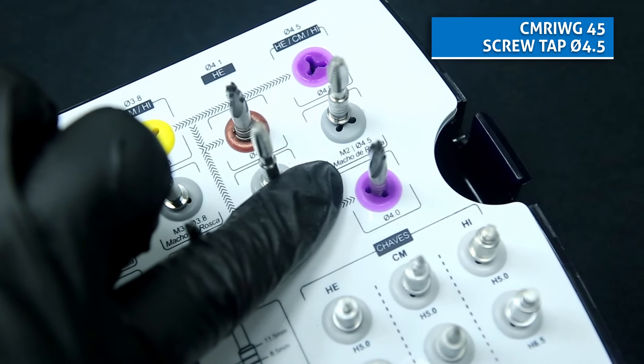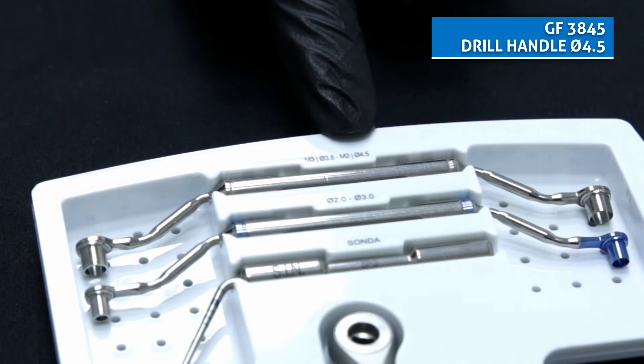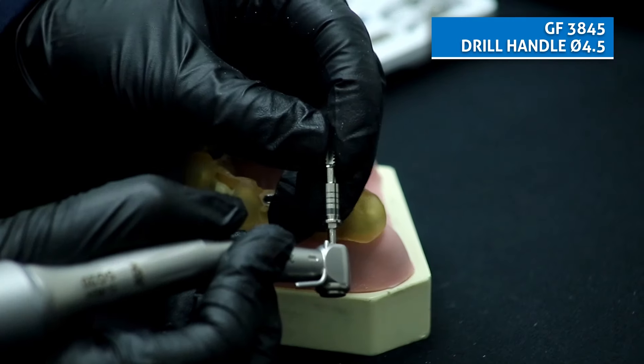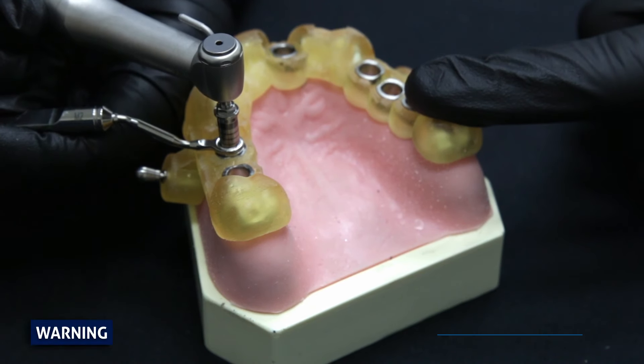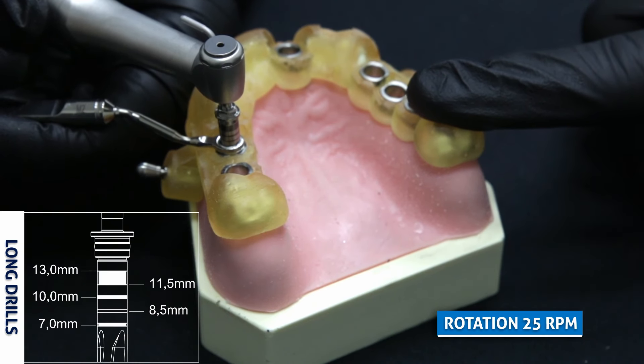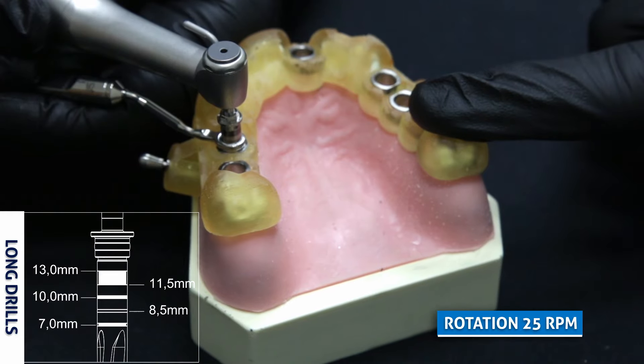Select the screw tap for bone types 1 and 2. Select the drill handle 4.5 and fit it to the hand piece. The screw tap has no fitting on the safe drill system, so the drilling must be visually controlled by the markers at a speed of 25 RPM.